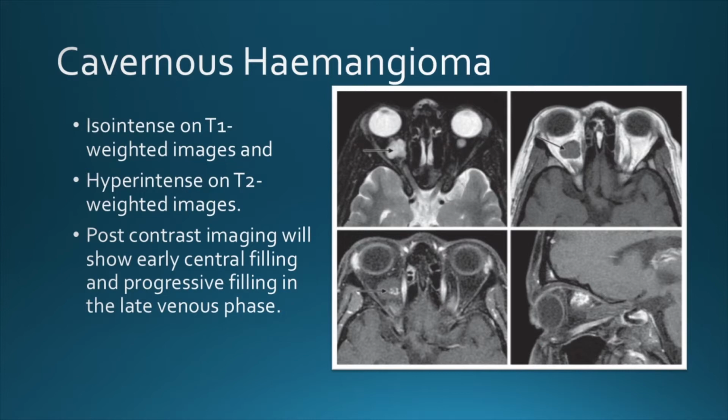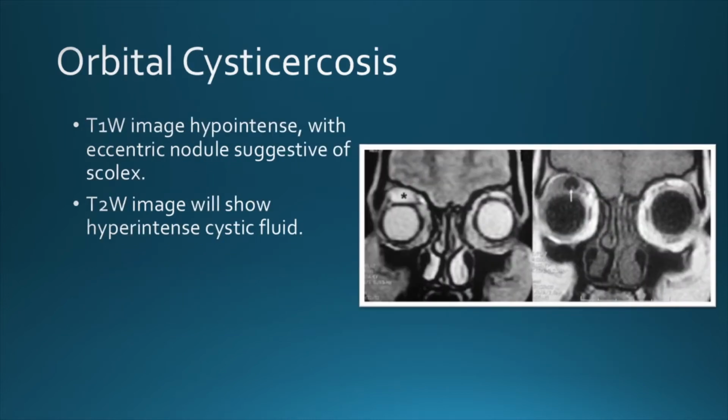What is the other modality in which you can identify the scolex? Ma'am, we can identify it on CT scan and USG, but on superficial, like surface, so basically superficial lesions. Intraocular and anteriorly located cysts you can pick up on ultrasound because that's easily available. But if you have deeper lesions, then you cannot.